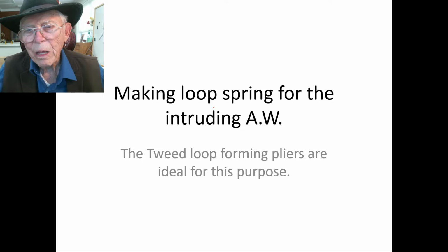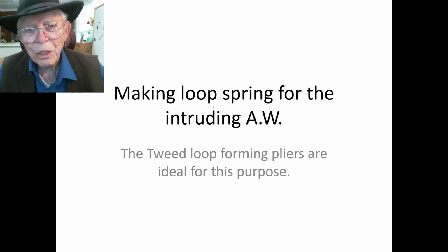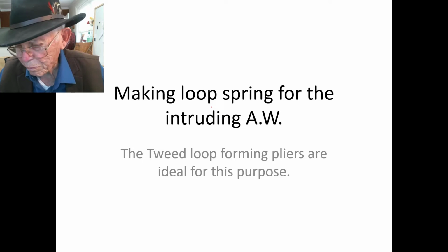And if you put these blocks and make them chew on that, you won't open the vertical at all. You'll just move the teeth into the bone structure, except the bone moves with the teeth. So just hold on here and we'll show. I've got dozens of cases of deep bite, and you can see the teeth look just as long after you level them out as they are in the other. So let's go ahead with this.